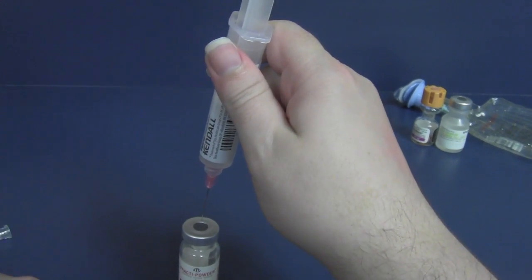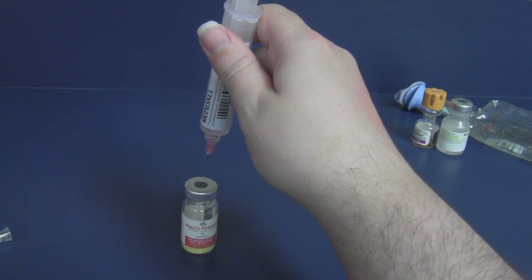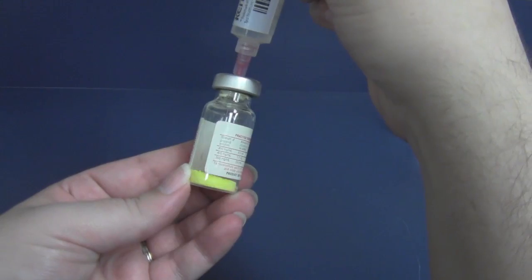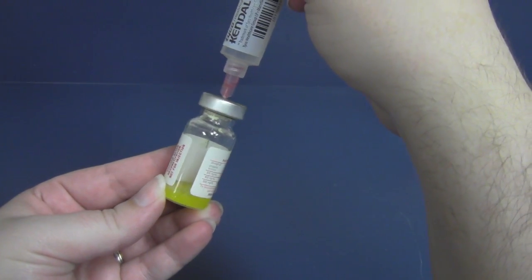and then I'm going to insert my needle into the vial and inject the solution.